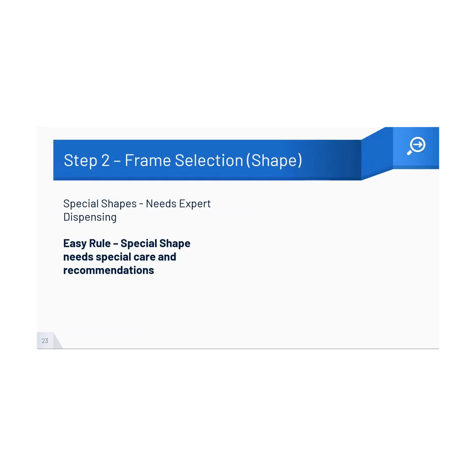Now, there are a few shapes which we try to avoid from the very beginning when it comes to progressive lenses. But generally, this should not be the case. With modern progressives, you have a lot of options to customize your designs. What I'm going to cover here, which was also put up on our post, is to give you an understanding, with simple animations, of how the shape and your overall progressive design will have an impact.